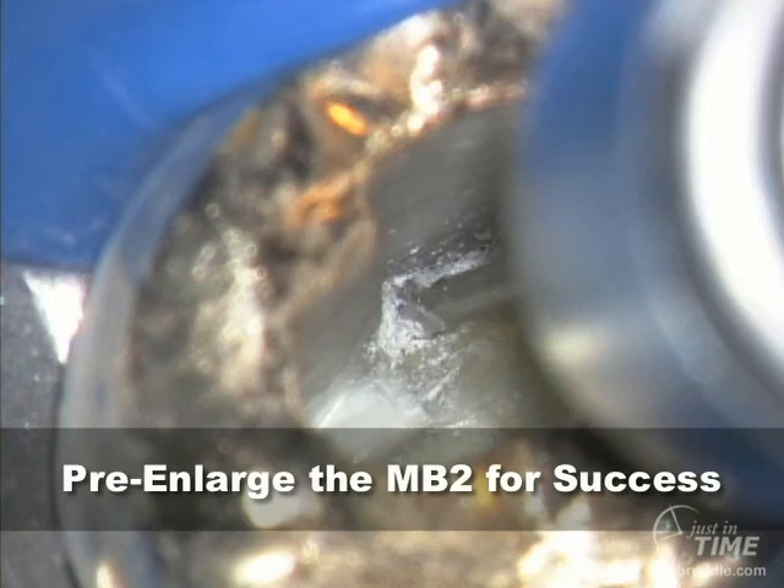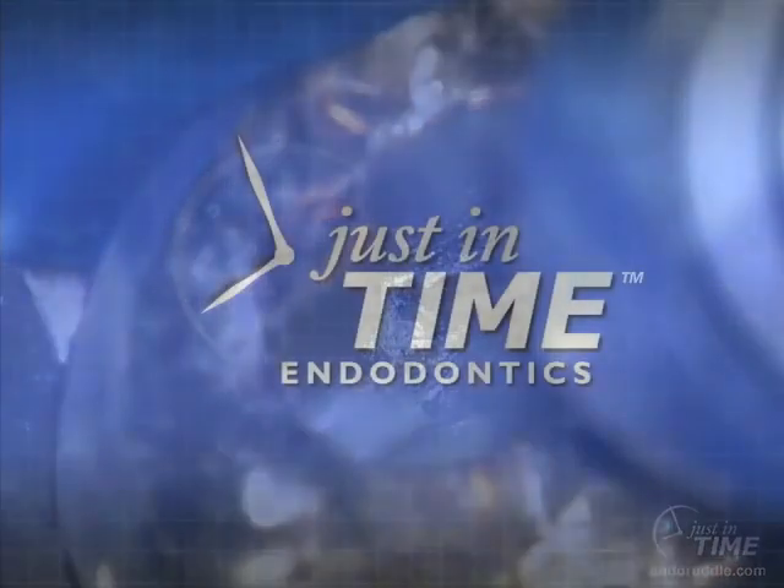Pre-enlargement techniques allow our small-sized hand files to work more easily towards the apical one-third. By managing the access cavity chamber, you can begin to find and treat, with great confidence, MB2 systems.